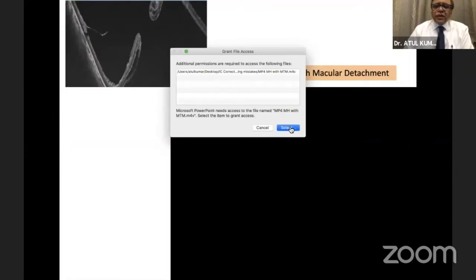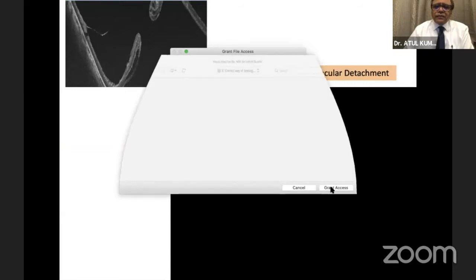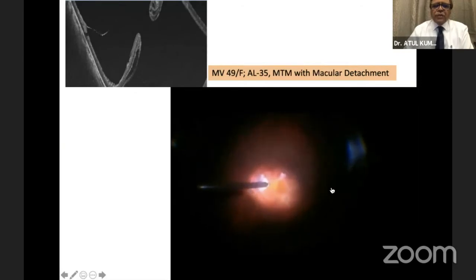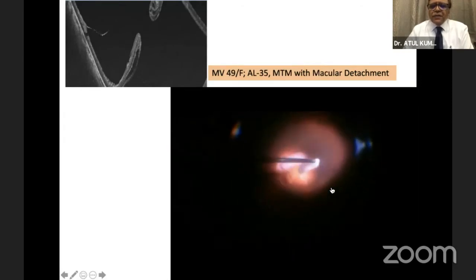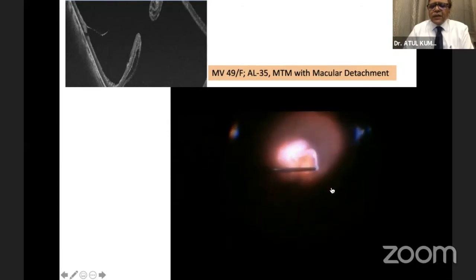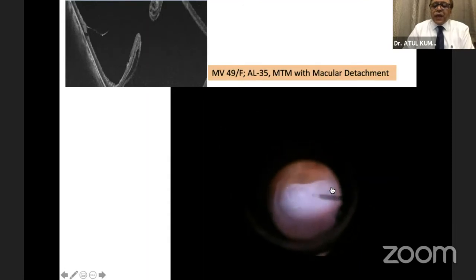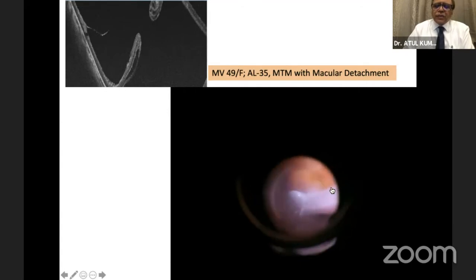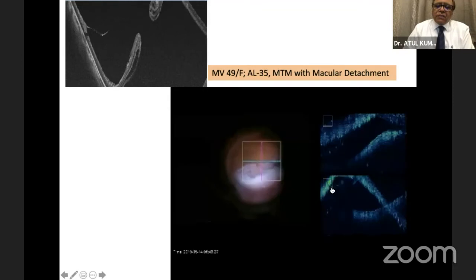So I'll just show you a little bit. So just a short video of the worst eye which we did. The axial length was 35 millimeters. Anything beyond 28, 29 millimeters, I realized that it's very tough to get the instruments to reach the posterior pole. And I tried with the long instruments, the myopic instruments, but they don't work very well because there's hardly any choice of array of instruments.